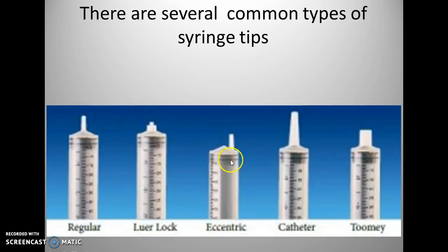Here you have eccentric. Notice it's to the side. Eccentrics are tips which are off-center and are used when the needle must be parallel to the plane of injection, such as an intradermal injection.